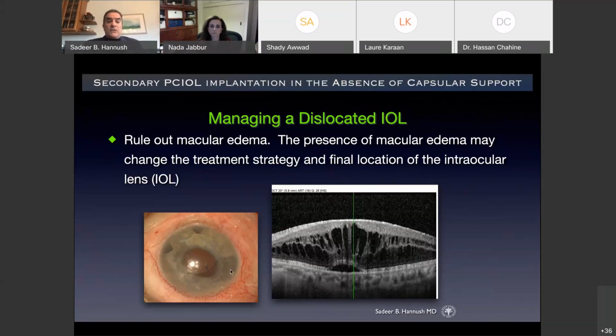So if this case were to be referred to a retina specialist, so the patient is looking through the optic of the lens, at least on this side of the Atlantic, this patient would first get peribulbar steroids, plus the topical steroid and non-steroidal. Then they may get an intravitreal injection of steroids, specifically triamcinolone. And then they may get an Ozurdex implant. And these things may temporize the problem for a while until it comes back. And the reason it's coming back is because, even though the patient is looking through the optic, the haptic of the lens is in the ciliary body, creating chronic inflammation.